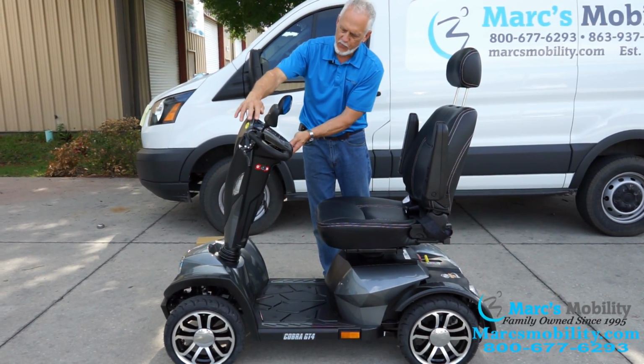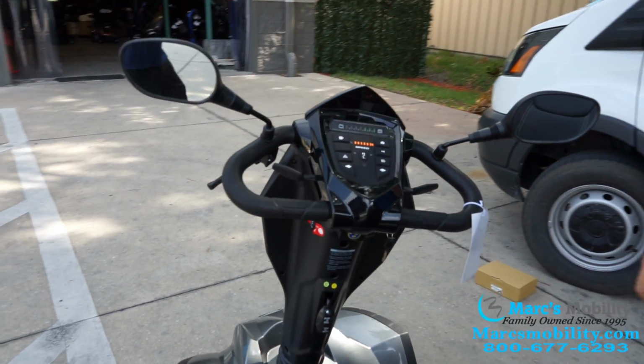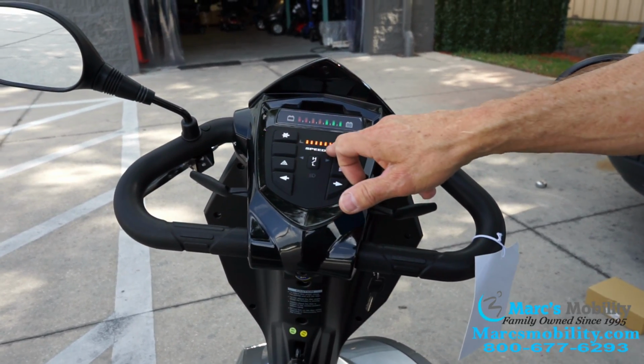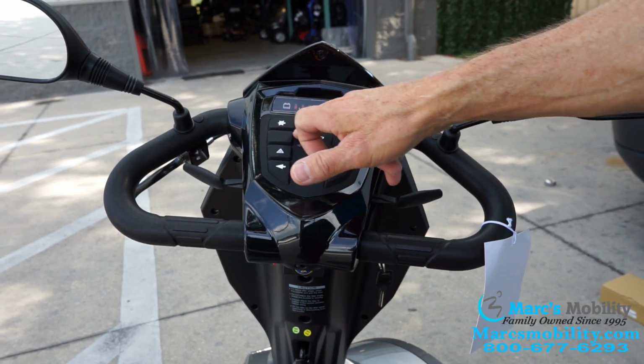If we look at the dashboard on here, you can see you have your high and low. If you're right here, we're on high speed. And if I hit a button here, we'll go to low speed, full speed at low speed.